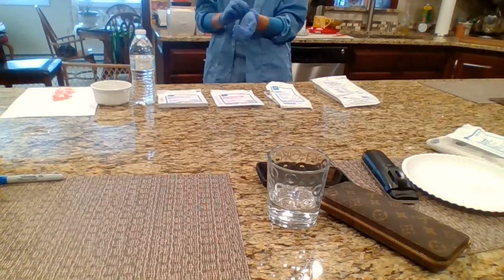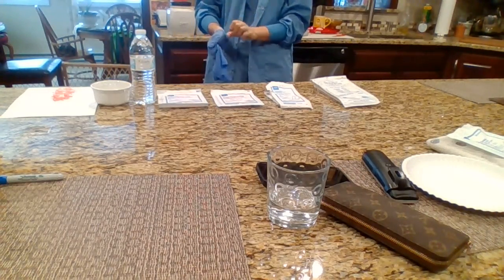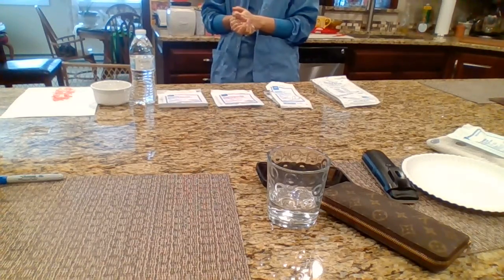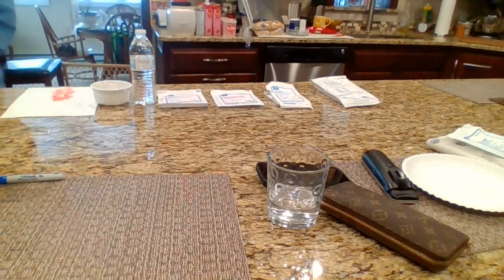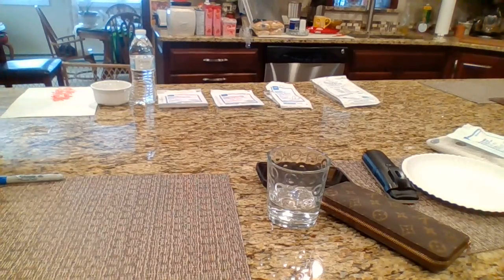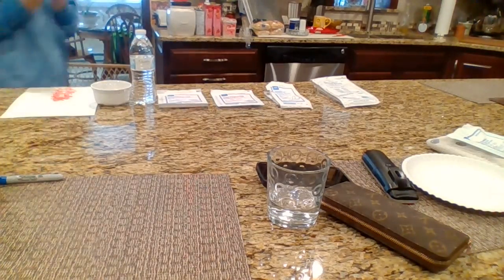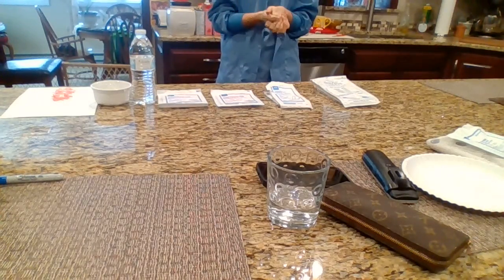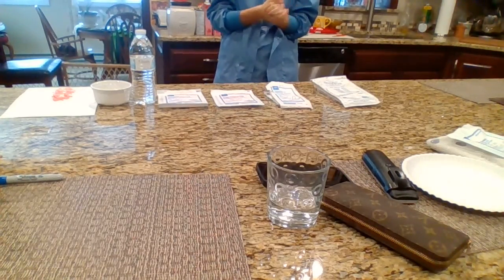So after I've assessed the wound and the drainage, I'm going to be done taking a look at the wound, so I'm going to take my gloves off. I'm going to toss those in the trash. I'm going to apply hand sanitizer again. So after the hand sanitizer is applied, I'm going to set everything up in the correct order and just go through and explain it.